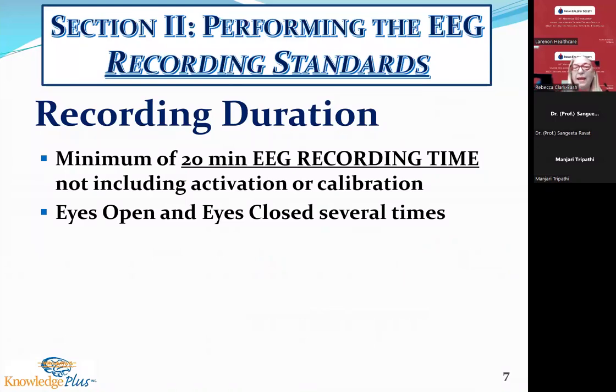Eyes opening and eyes closed are used several times at the beginning of the recording and at the end of the recording. So this is great if in the first 10 seconds you start your EEG, it's very flat, you don't really have much of a posterior dominant rhythm. I'm going to have the patient open and close their eyes. I will say, Helen, open your eyes and close your eyes, just very briefly to look at the reactivity of the posterior dominant rhythm.